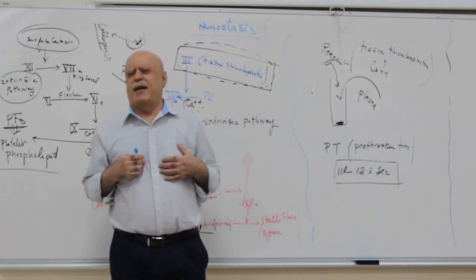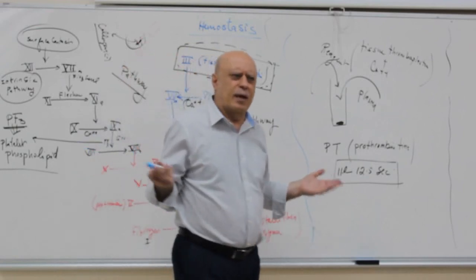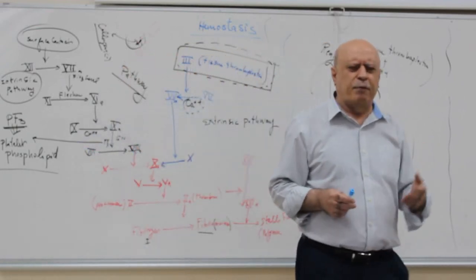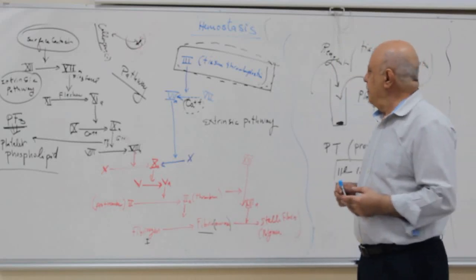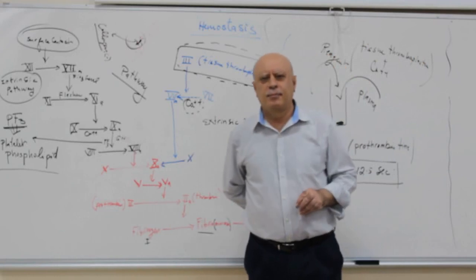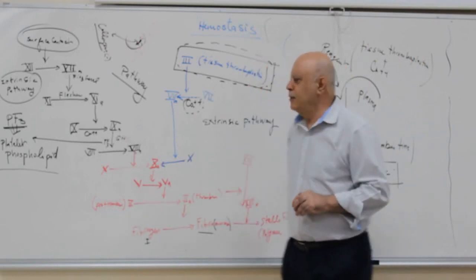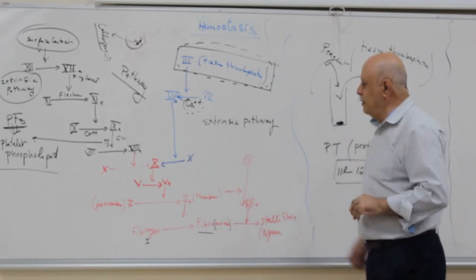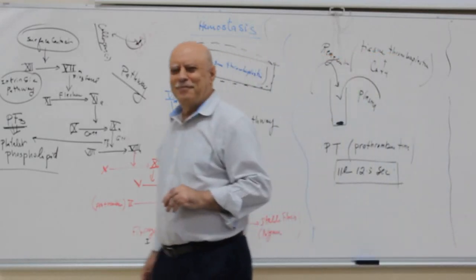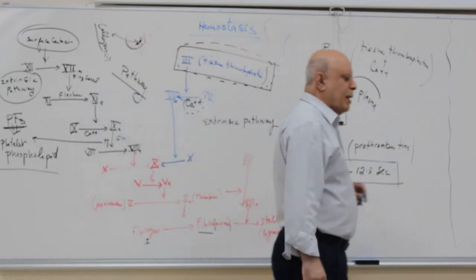In the plasma, we have calcium. Of course, we have calcium. And we're going to measure it maybe in a couple of weeks in clinical chemistry. Why do we still have to add calcium? Of course. Yes, exactly. Very good. You guessed it.